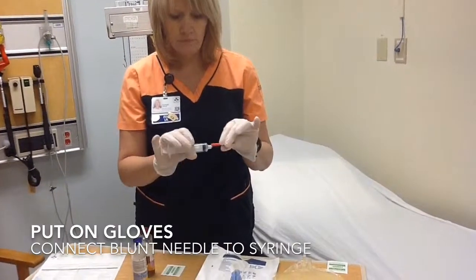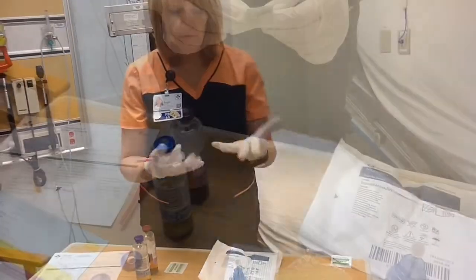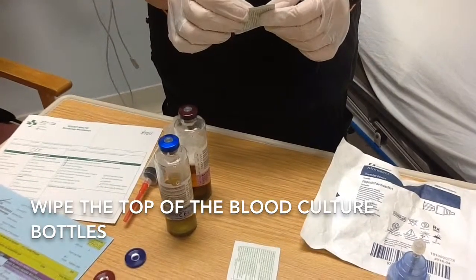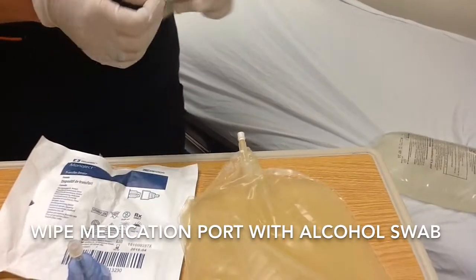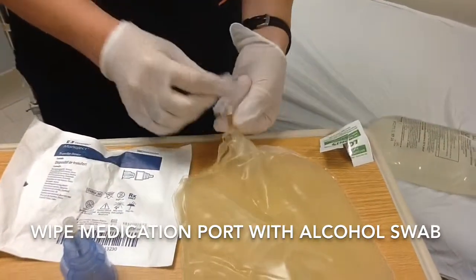Put on your gloves and put the blunt needle on the syringe. Wipe the top of the culture bottles with an alcohol swab. Wipe the medication port with alcohol for 15 seconds.